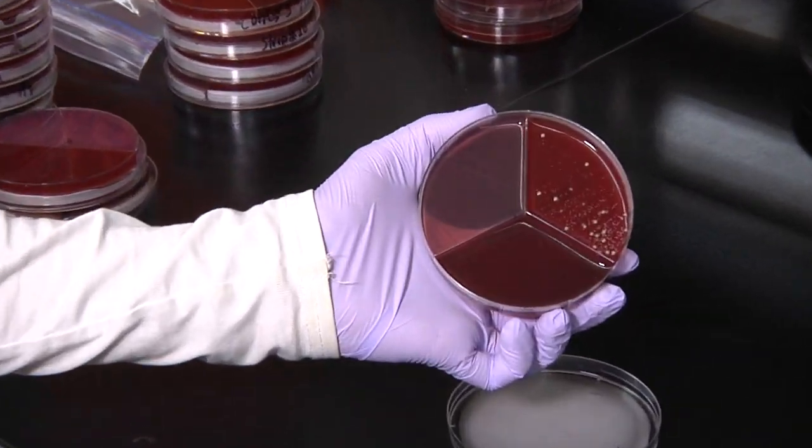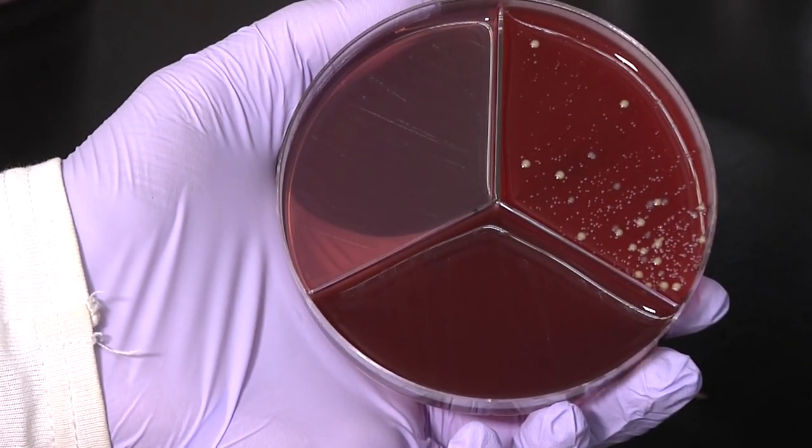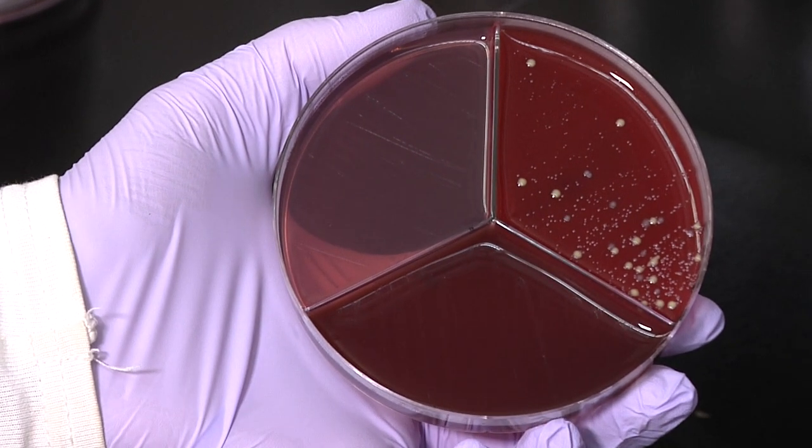Our rule for contamination is that if there are greater than two different types of colonies on the plate, that plate is likely contaminated. And that contamination could occur during obtaining the aseptic sample or during handling and inoculation of the media. The plate that we're showing here is a great example of a contaminated plate. We have three different types of colonies present on this plate. We've got some small white colonies, a couple of medium gray colonies, and some large yellow colonies. This is a good example of three different colony types, which indicates that it's likely the result of contamination. It's pointless to try to make any sort of diagnosis with a contaminated sample. The contaminated plate simply can't be used for diagnosis. Our goal on our farm should be to have less than 5% of the samples result in contamination.